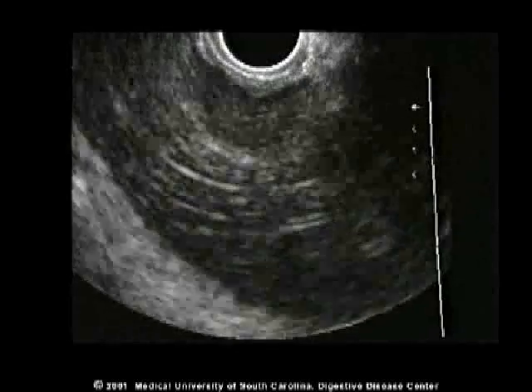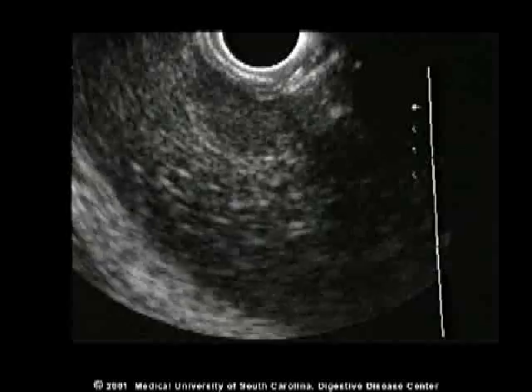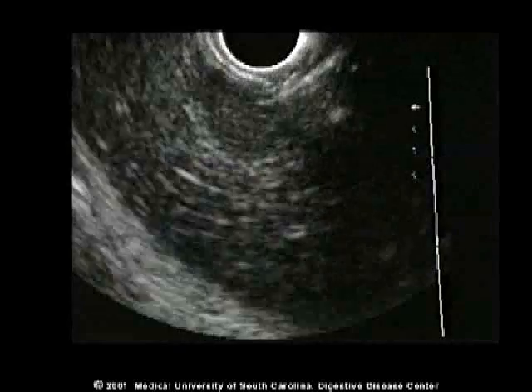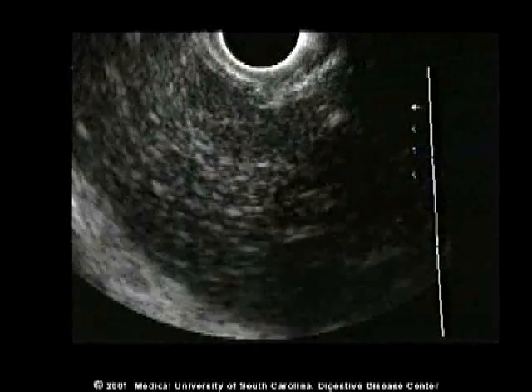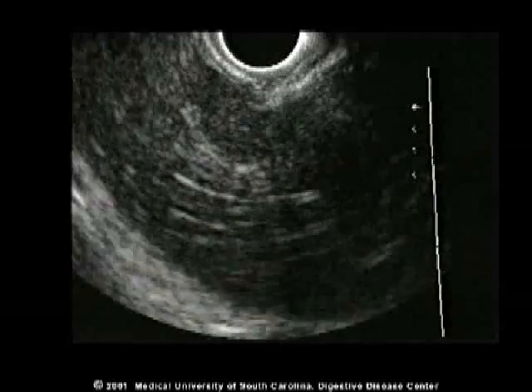Liver metastases, in this case, appear as a hypoechoic lesion within the parenchyma of the liver. The scope is placed in the stomach to identify the left lobe of the liver in this case.